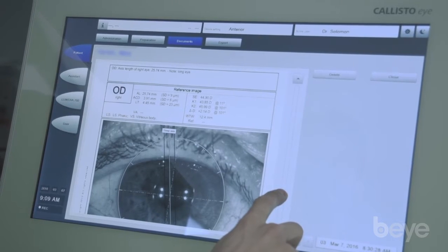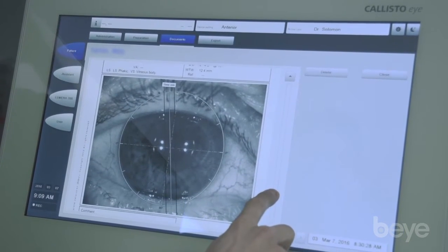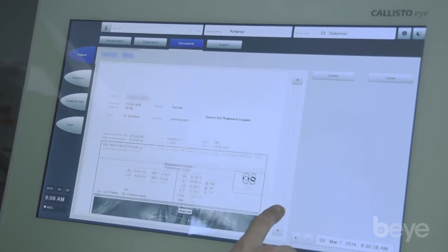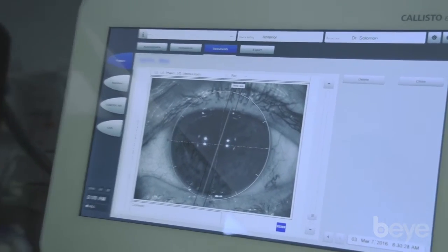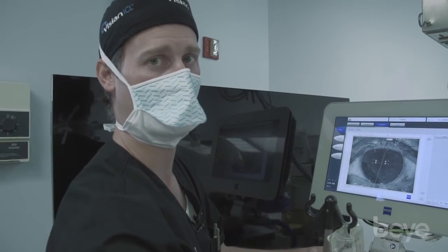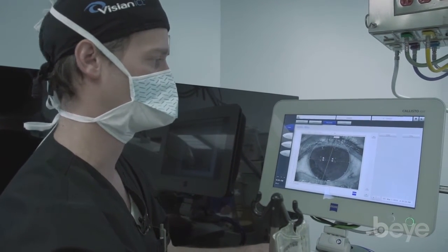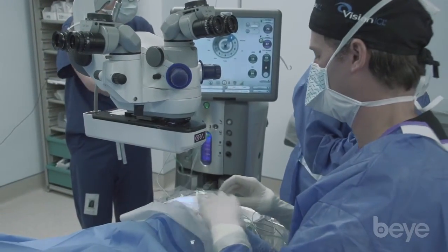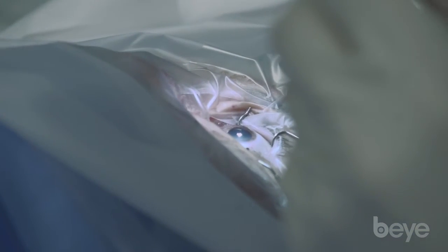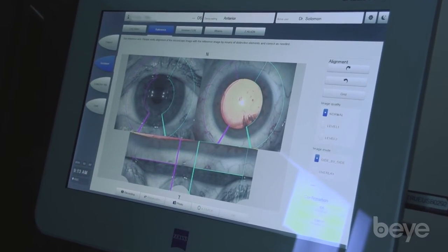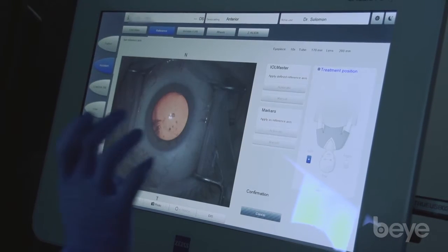This is in a static state, and looking at the steep axis is particularly helpful. In this case, we're going to be treating the left eye. After thorough conversation with our patient, she's elected to move forward with a toric IOL in her left eye. Our goal is to consider a monovision setup, so we're looking for a low myopic correction to assist with her reading capability. Let's do our automatic registration — and you'll see it is registering based on landmarks that it is seeing. Go ahead and fire forward.